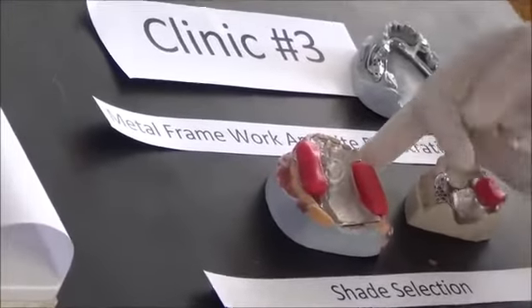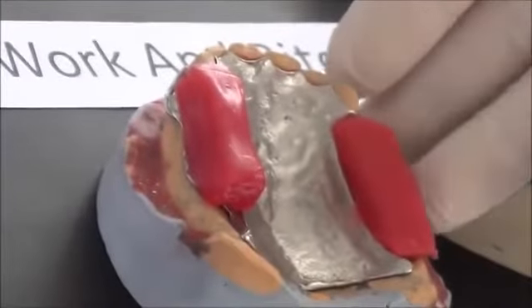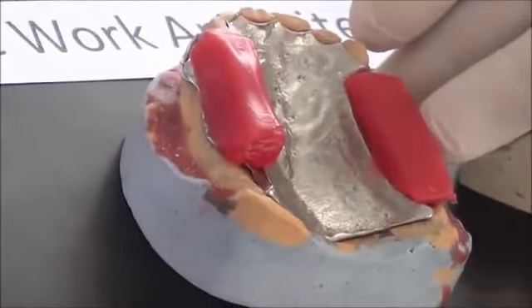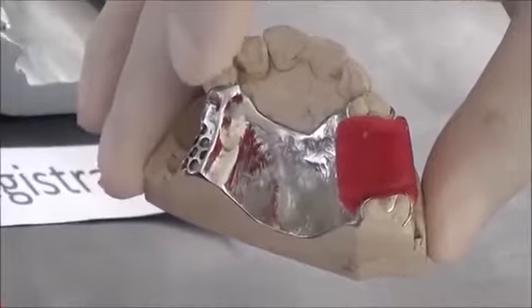So we make the wax blocks according to the instructions you have taken in your lab. We are going to do the same clinical steps that we're going to do in the clinic. But for the bounded saddle area, we simply place a block of wax and tell the patient to bite on it. This is called a bite record. We also select the shade for the teeth we intend to use. So we do a shade selection.